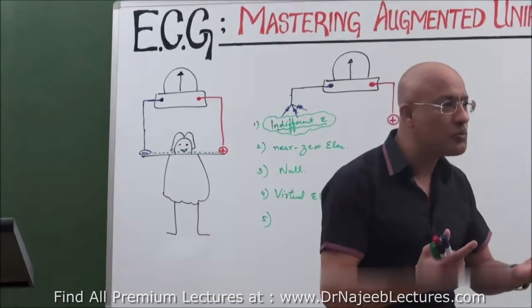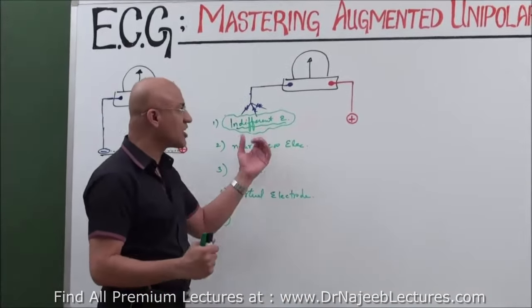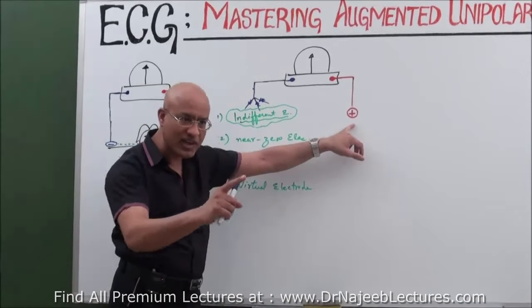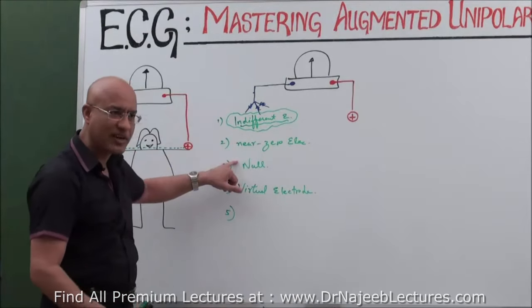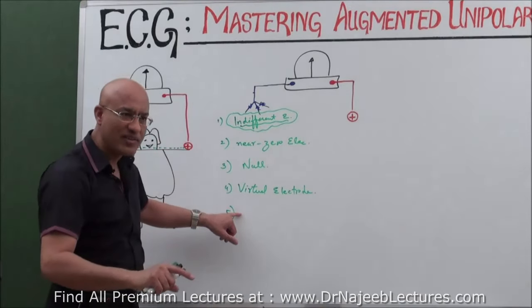So what is a unipolar ECG lead? It is basically constructed by an exploring electrode, the positive electrode, and the negative terminal as an indifferent electrode: the least bothered electrode, zero potential electrode, virtual electrode. You are getting it? Null electrode.